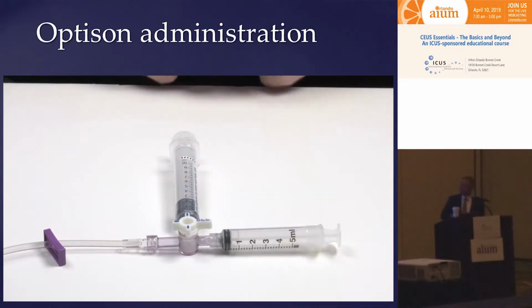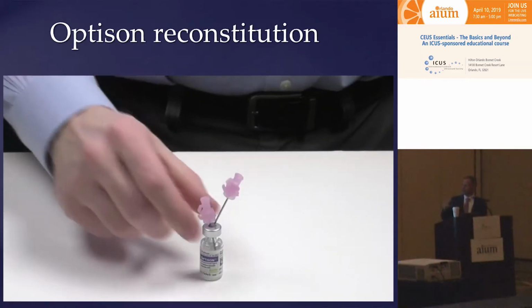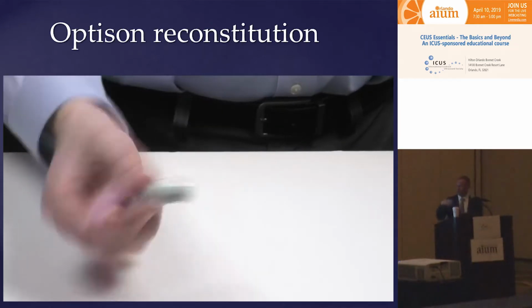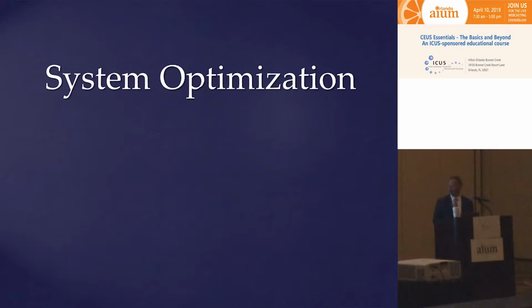Optison also, same as other agents, will separate, so all you need to do is gently shake this vial of contrast agent to reconstitute those microbubbles that will be floating on the top of your vial, and you will be good to go. All right, system optimization to start.